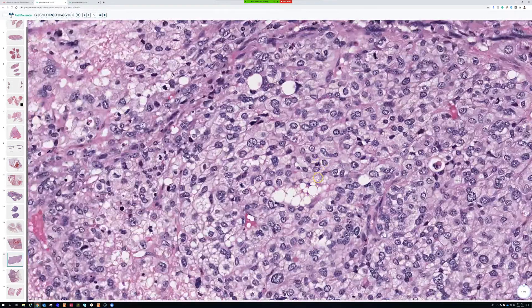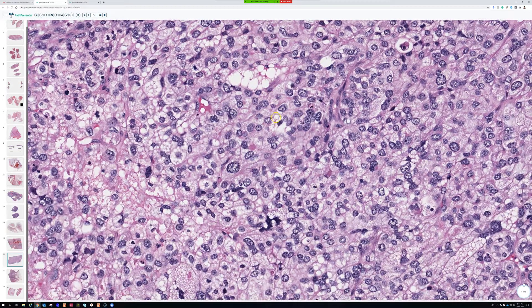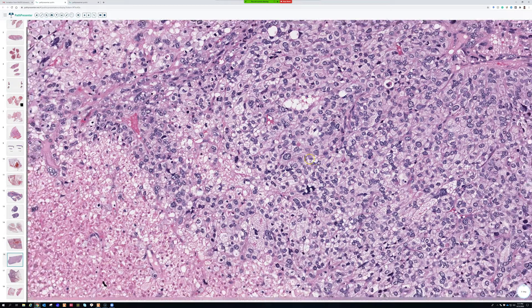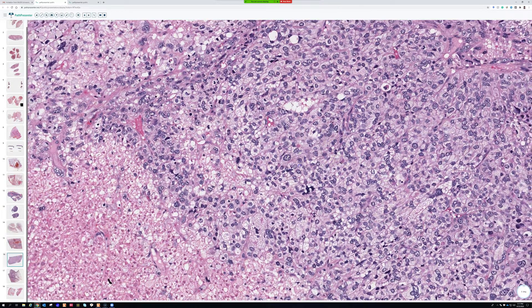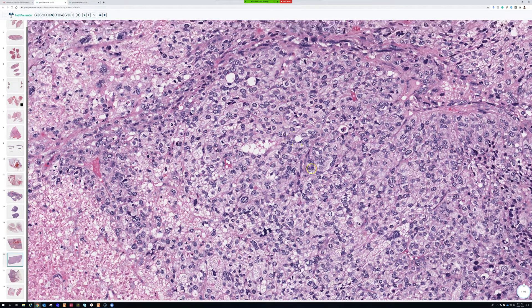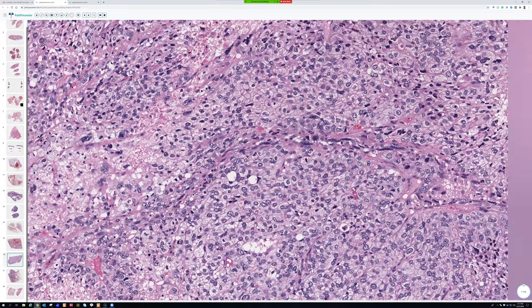You get multi-loculated, multi-vacuolated pleomorphic lipoblasts of varying size. All of the cells have round nuclei and abundant cytoplasm, and even the ones without good vacuoles have a frothy, foamy cytoplasm that looks xanthomatous — you can tell there's lipid in there, even though it's not formed in nice big bubbles.